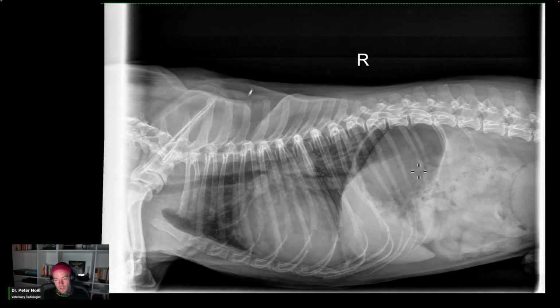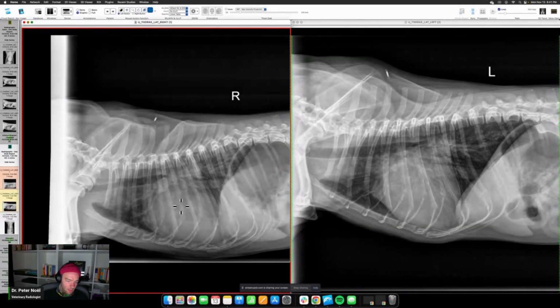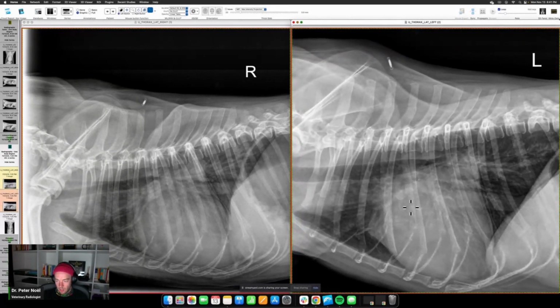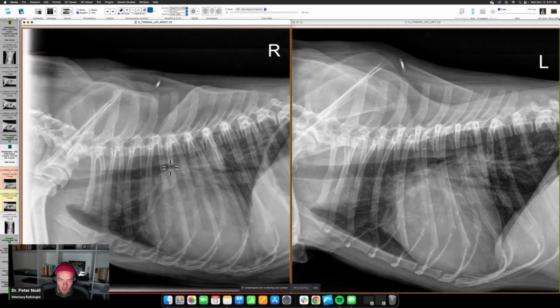It does. So when this trachea or the trachea comes down, look at this view. So if you got that view, we're going to do the right lateral here. And so this view, the trachea comes down like this, and you can see right here, you can kind of see where it branches. Okay. It just looks more radiolucent, more gas filled here. But then when you look over here, you're just like, wait, what's going on here? Okay. So what's going on there?